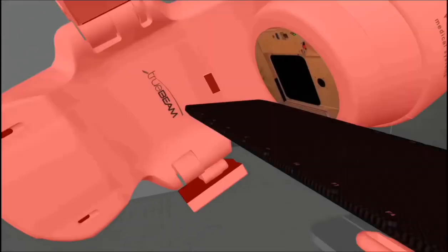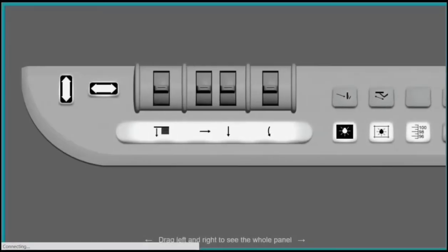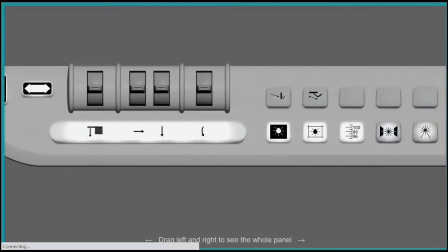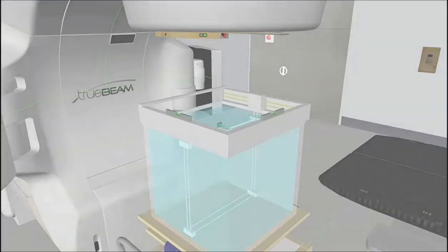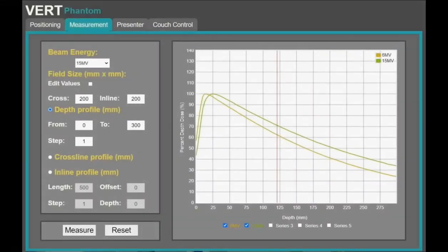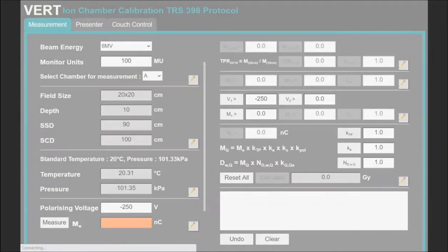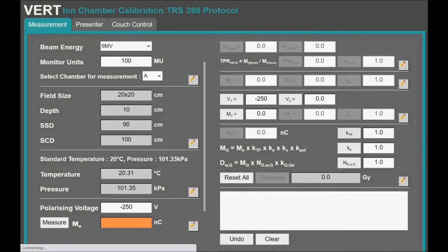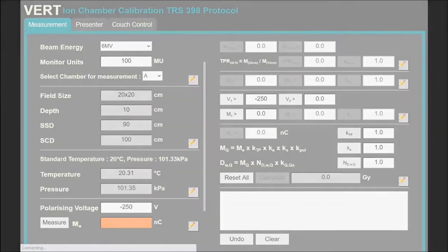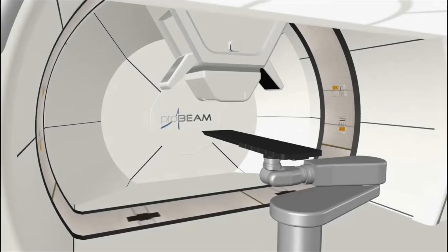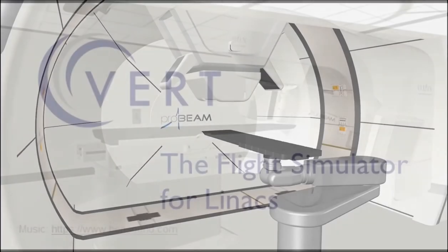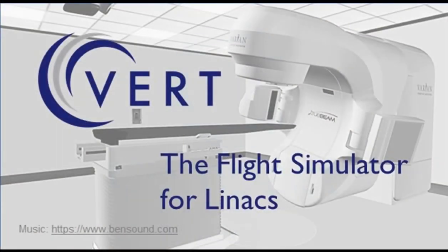What this video shows you is a fraction of what the VERT system can do and how it can help you take your service to the next level. We also offer a QA module, a physics module and a proton module. If you would like more information, please contact your sales representative to book a demonstration. Thank you.